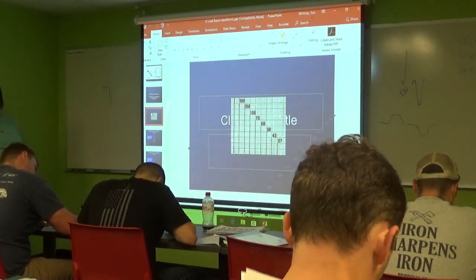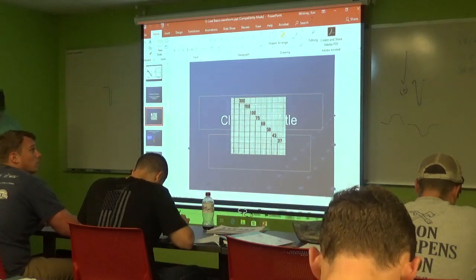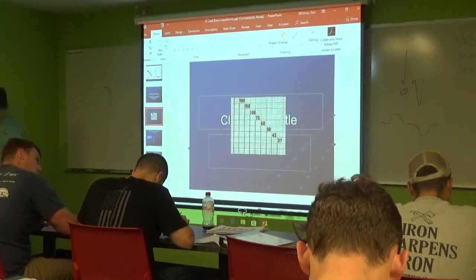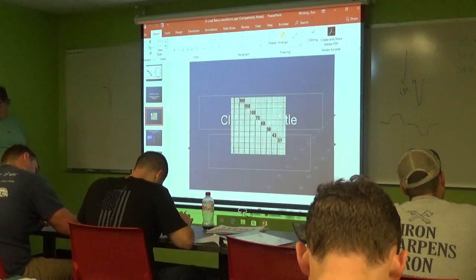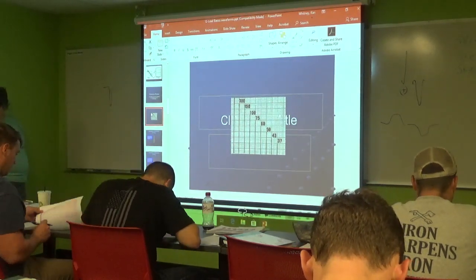In the beginning, what do you have there for QRS? It's 0.06. It's actually pretty small, but it's still considered normal. It's not wide, that's what we're looking for.